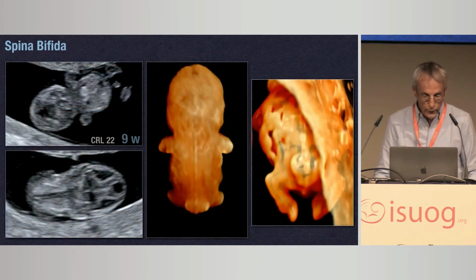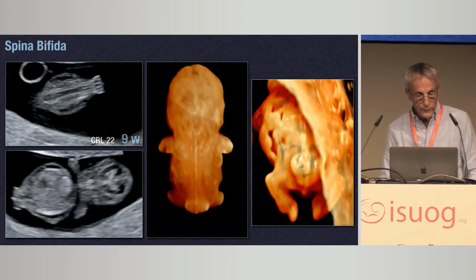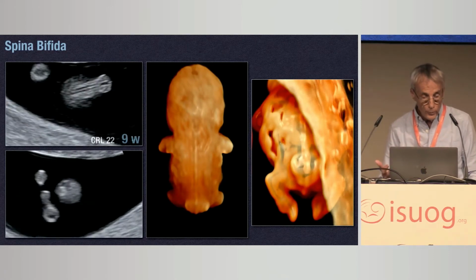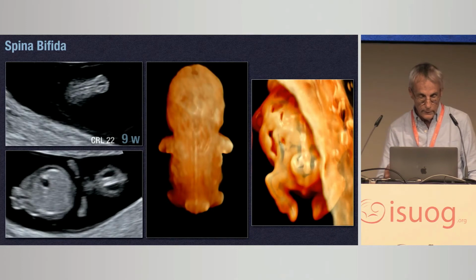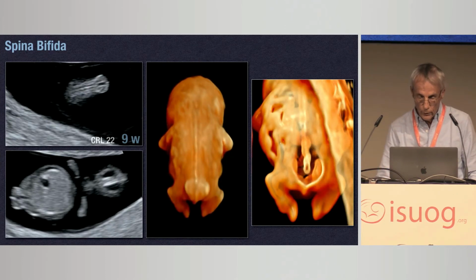And I had another case. This was another case at 9 weeks of pregnancy, spina bifida. It was a low-risk pregnancy, but I did the screening, and you can see the spina bifida here, here, here, and with 3D, with different render modes.